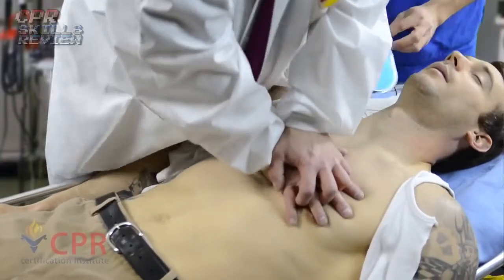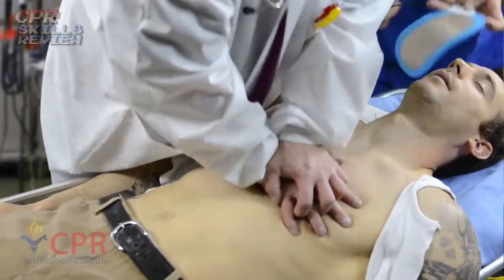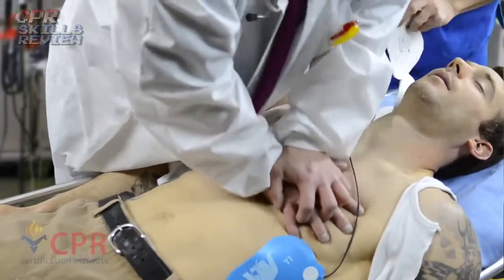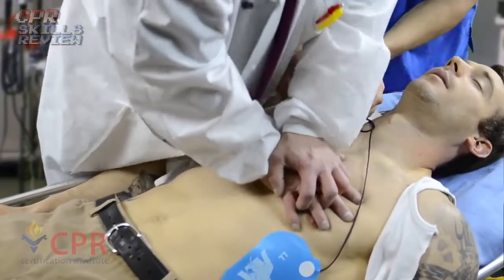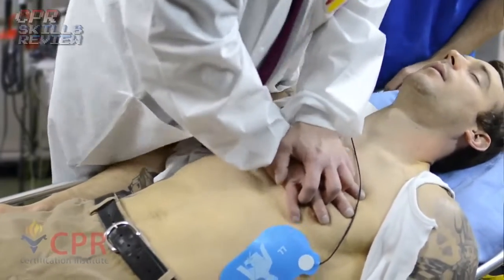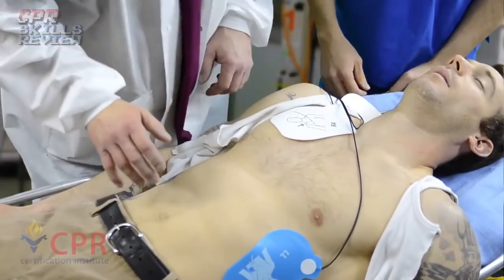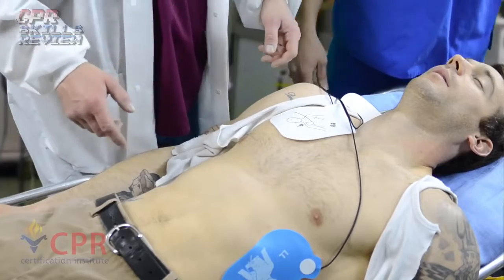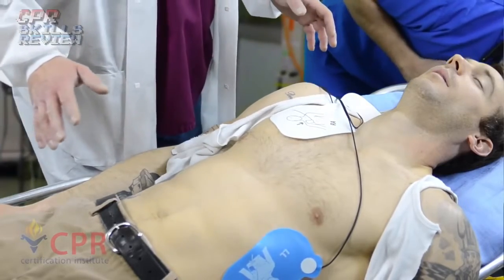Place electrodes. Do not touch patient. Analyzing rhythm. Stand clear. Push flashing button. I'm clear, you're clear, we're clear. 3, 2, 1 — shock.